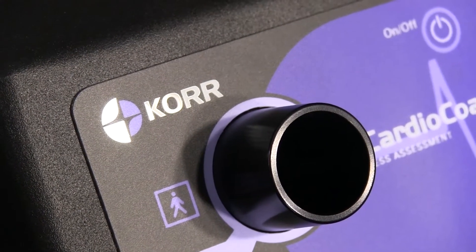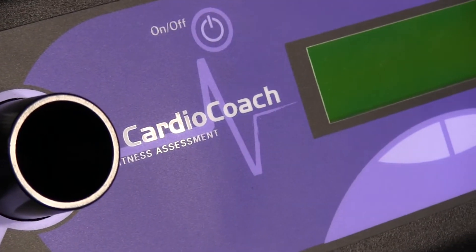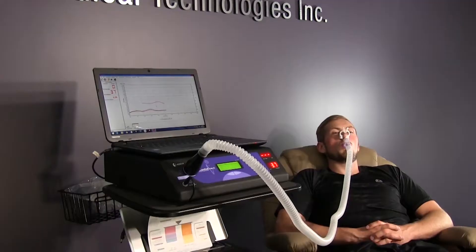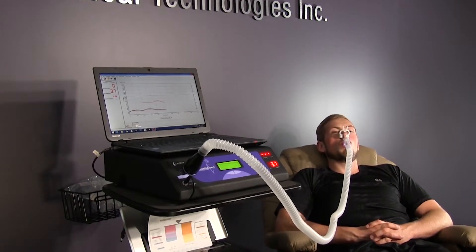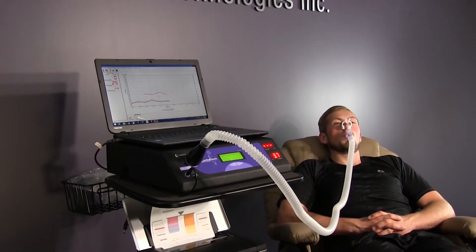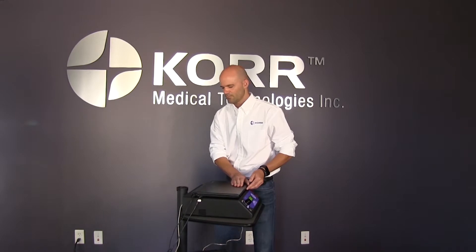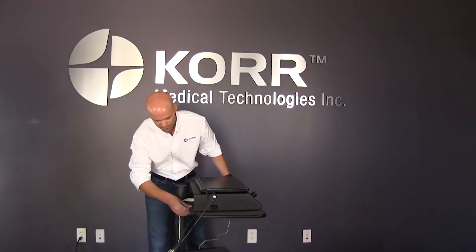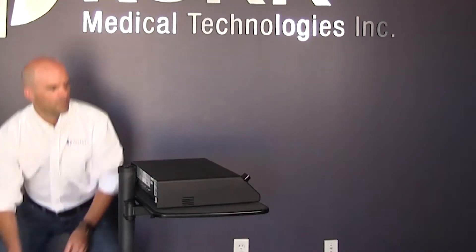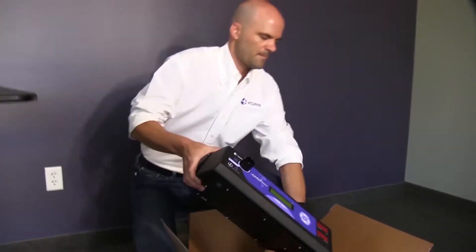It is important to understand that routine service and maintenance will be necessary for your KORR product. KORR measurement equipment relies on oxygen sensors that have a lifespan of 18 to 24 months regardless of usage. When those sensors expire, your unit must be sent back to our facility in Salt Lake City, Utah for replacement and recalibration. Service is ordered through our website at korr.com.